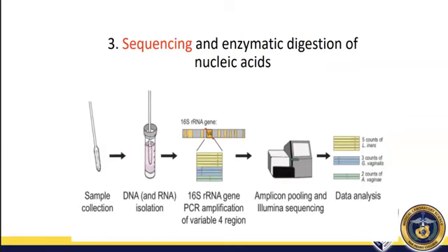And then, medyo mahaba kasi siya. Okay? So, mga around 1,540 plus base pairs ang haba niya. Okay? So kaya ideal siya for most identification. Okay? And then for some, like sa mycology, for dematiaceous fungi, for example, pwede rin naman yung calmodulin genes. They could serve as targets for sequencing.